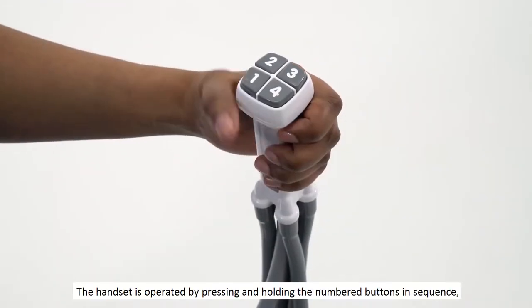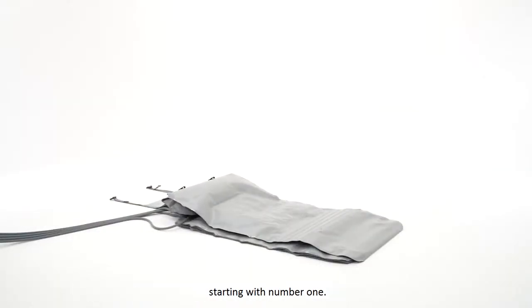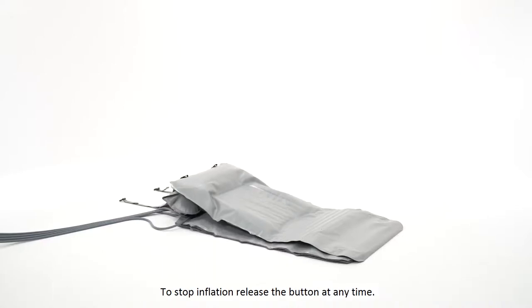The handset is operated by pressing and holding the numbered buttons in sequence, starting with number one. The backrest will now start to inflate. The backrest should be inflated until the person is comfortable. To stop inflation, release the button at any time.